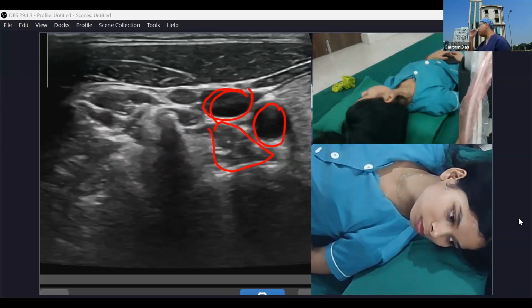First, I wanted to tell you that this is our homepage. Identify this picture. I am just asking you to see and identify this one. All other structures I'll show you much more clearly. First, at the middle of the screen, this is your anterior tubercle. Try not to miss it. Scan a little up and down and try to identify the anterior tubercle.